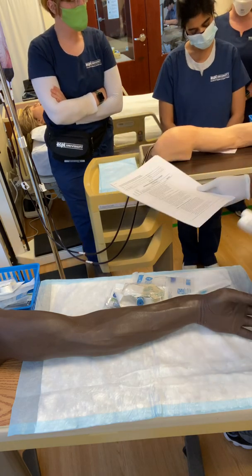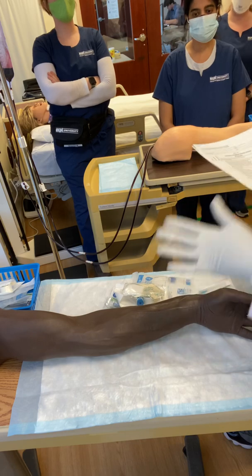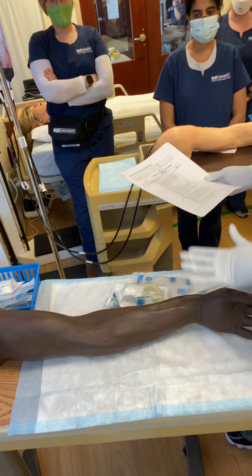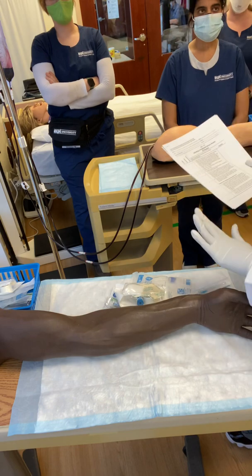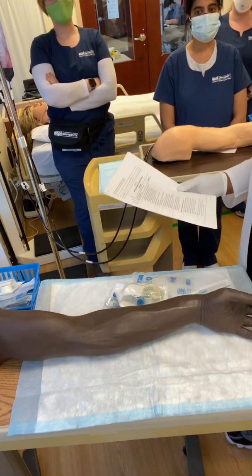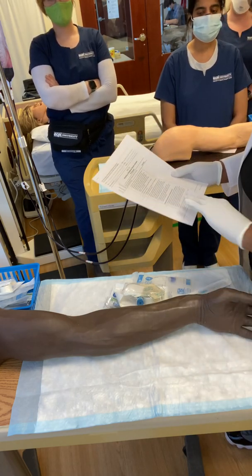Okay. So sometimes in patients, we'll have to use like maybe a local anesthetic if they're really super sensitive. So we might apply like lidocaine, like a lidocaine cream or something. I've had to do that before to patients, especially the frail, older patients. They're really sensitive. So I've applied like lidocaine cream or something just to numb the area for them. But ultimately, that's what we have to do.